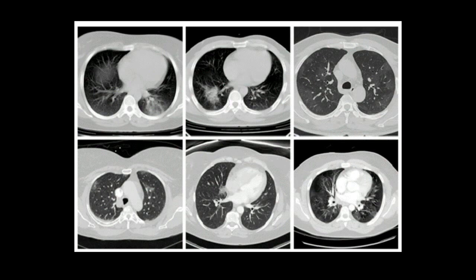All of these comparisons, virtually all of them are skewed and hard to read analytically, but I'll just show you this case, this set of examples, which is illuminating at the very least. This top row was nailed as COVID-19 and ultimately proven by the AI, but the radiologists were less impressed, I guess because of somewhat less typical findings, at least to the radiologist eye. The bottom row, both the radiologist and the AI performed reasonably well at making that diagnosis.